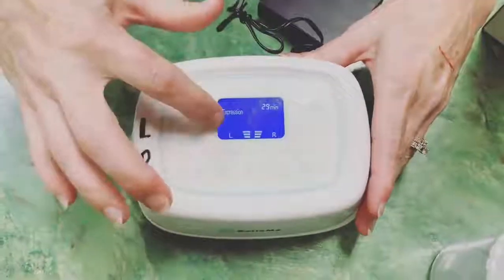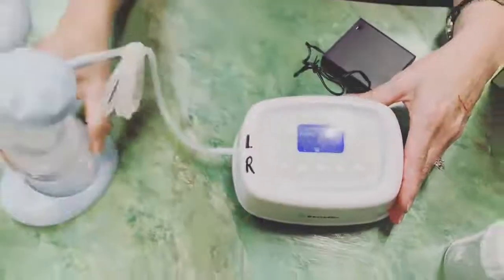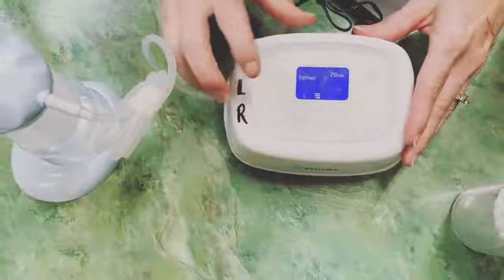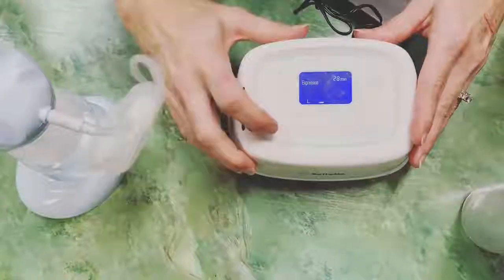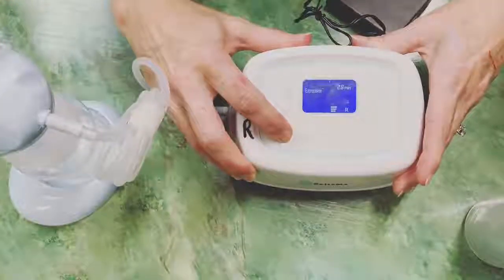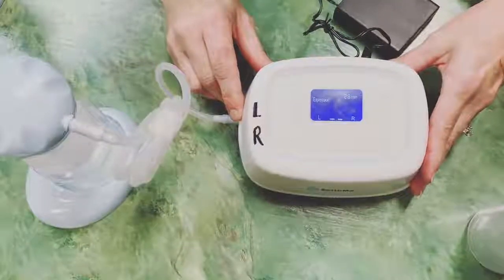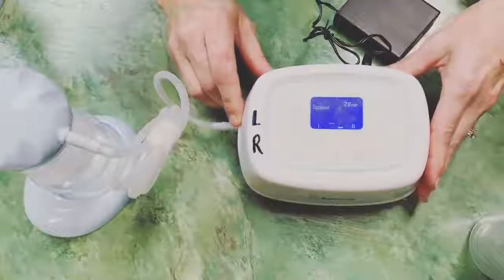When you turn this pump on and you go into expression mode, you hit that first button, and because you have your pump plugged in, you know that this hose is attached to the right side pump, and then you're going to use it to catch that expressing milk. You can also do this by having your left, right, and dual, as if you're feeding more on one side, prominently the left, you can go over and adjust the right side to a higher suction level, and when you're pumping in between feedings, you can pump at 2 separate levels. That way, you're still keeping your milk production at the same level and keeping the same amount of milk flowing, and we're not getting a little off kilter as a mom.